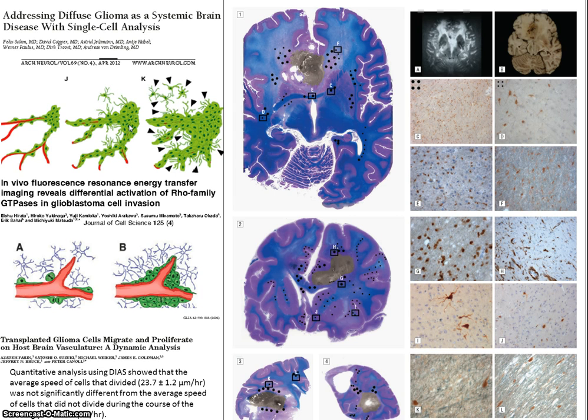They seem to go into the rats and mice quite nicely under certain conditions. But anyway, this is what they observed. There's migration along the vasculature. So you notice that the vasculature is growing into this site, or this is existing vasculature, and they're beginning to spread along it to grow into a larger mass, however you want to look at it.